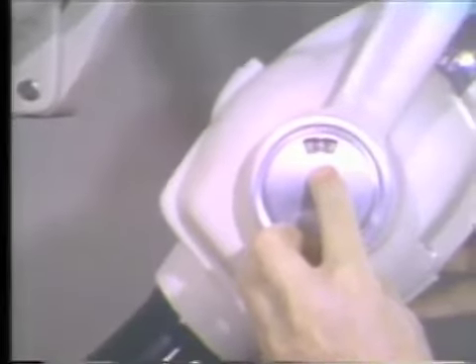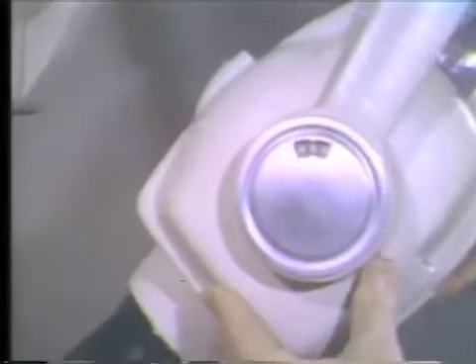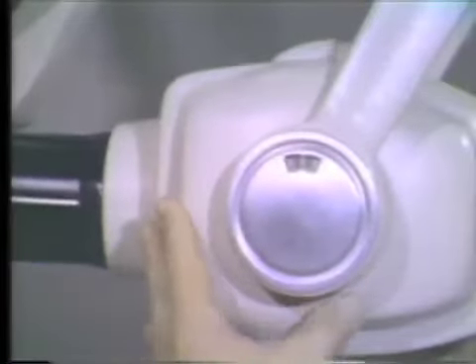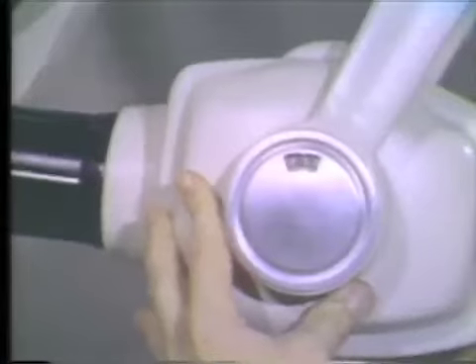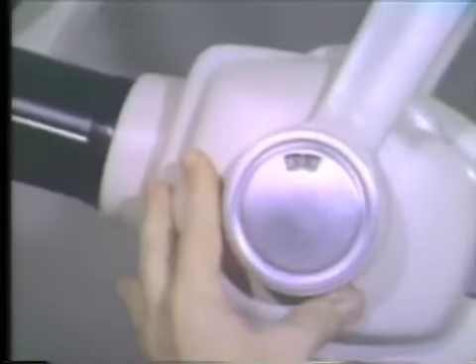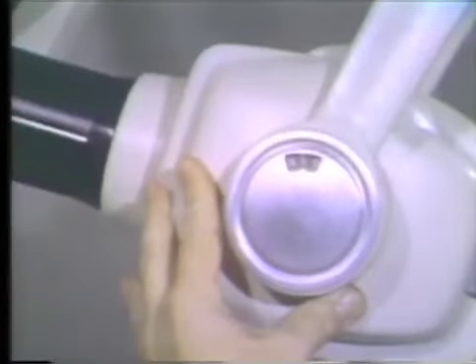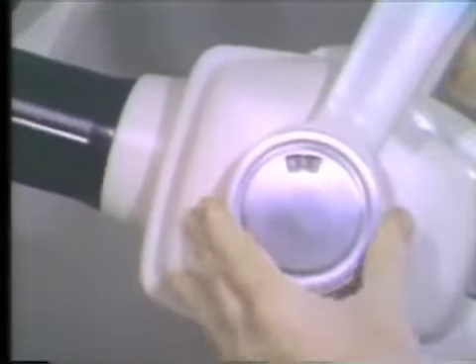Then the vertical angle indicated on the scale, in this case 45 degrees downward, is increased through 60 degrees in an upward direction. The final correct vertical angulation for this particular position of her head is 15 degrees upward. Remember that the angulation must be computed in this way each time the technique is used.